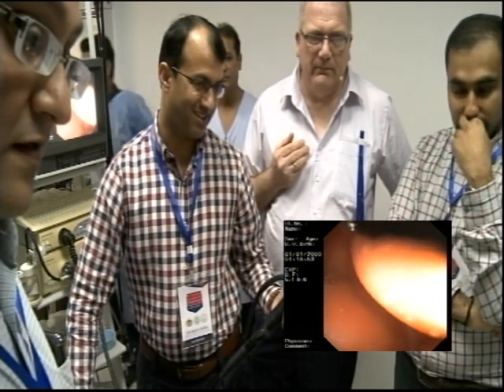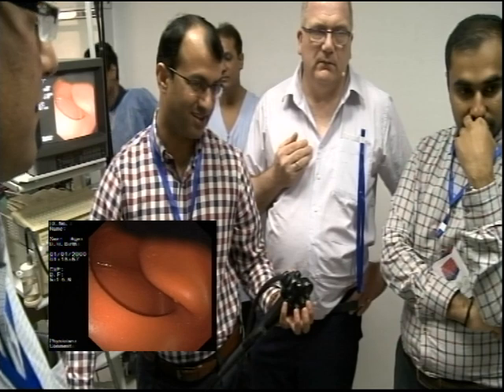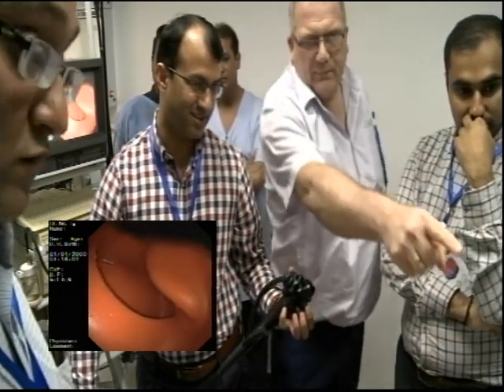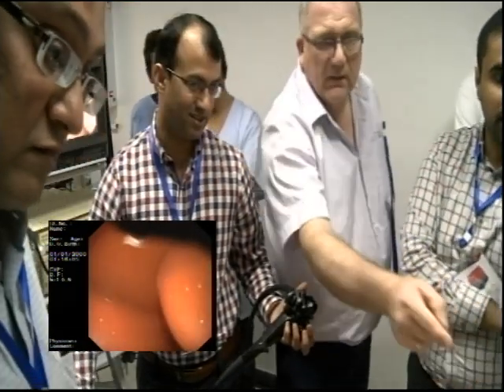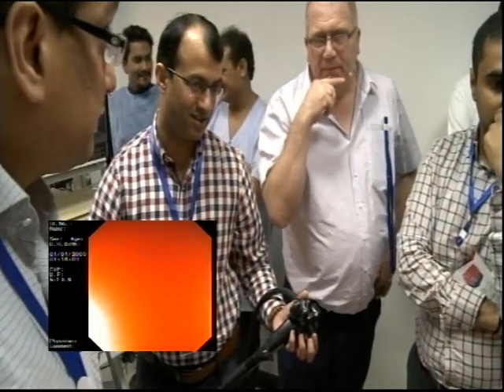Draw back the scope slowly. What's at six o'clock? What's over that fold there? This fold to the left — yeah? Remember the fingers.